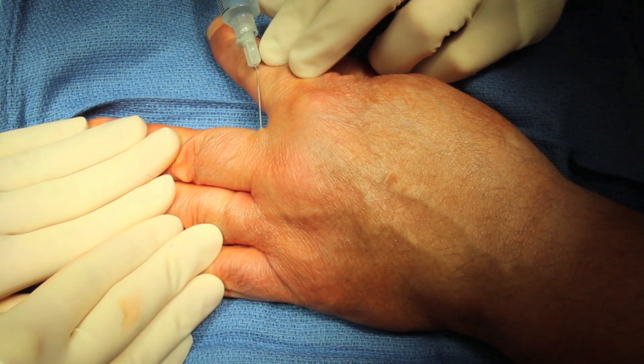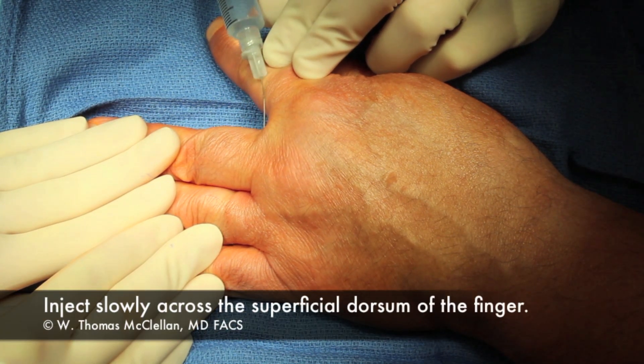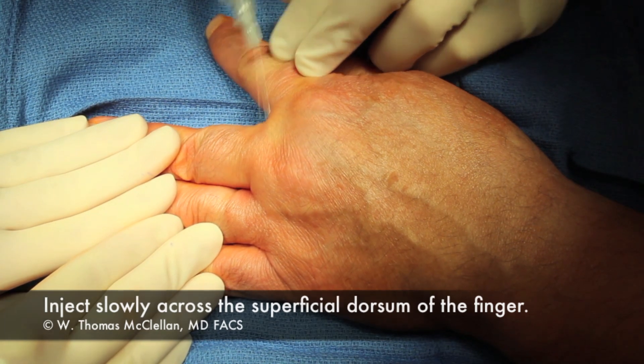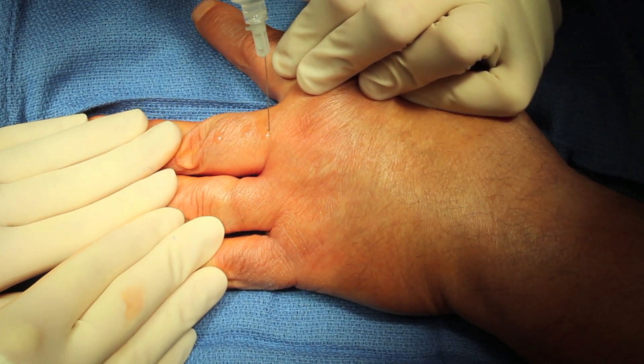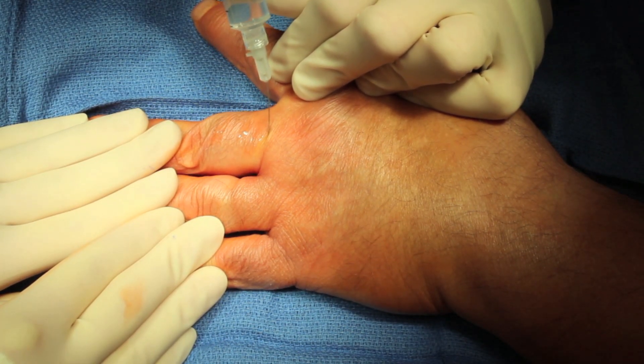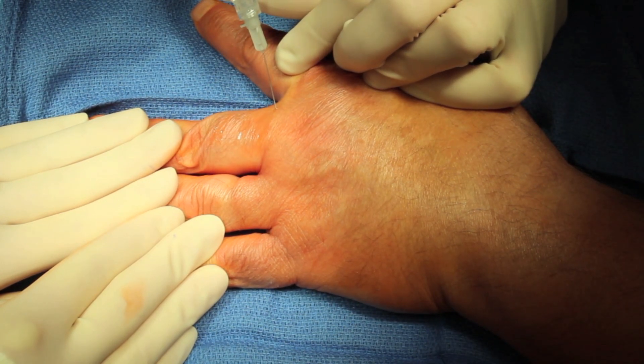Then I'll roll the hand over and come across the dorsum of the finger. Again, very superficially — you can see the local anesthetic being delivered under the skin there. Generally I come up the finger and come down the finger on the second injection, completing the circle around the finger.